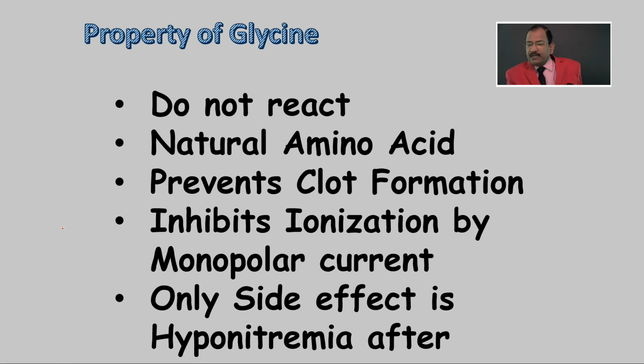Another big advantage, it inhibits ionization. It does not allow electrolysis to happen, and whatever current you are using will be available for the tissue. Because of the lack of ionization, the current will not disperse to the lateral wall. So, glycine is inhibiting ionization.